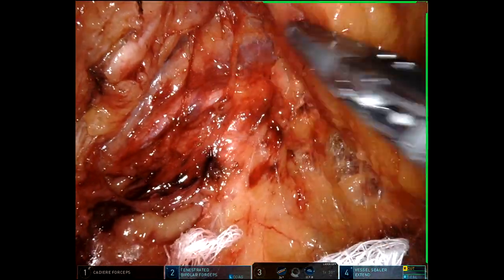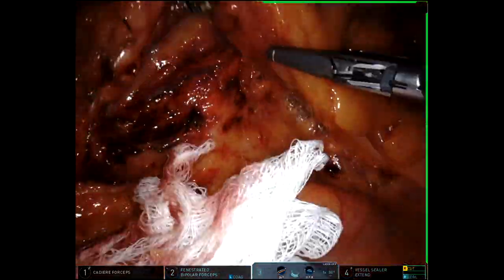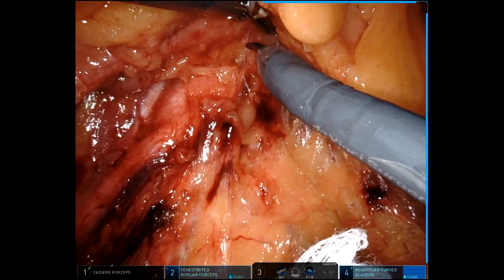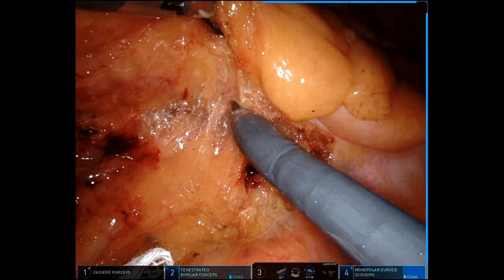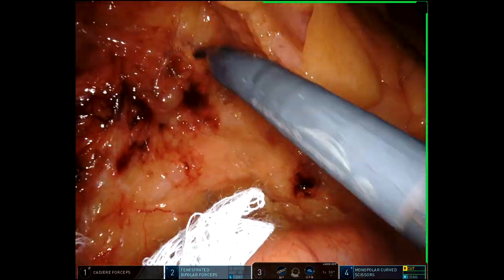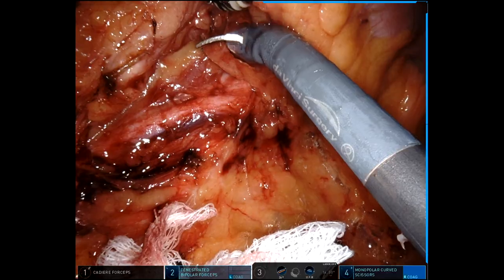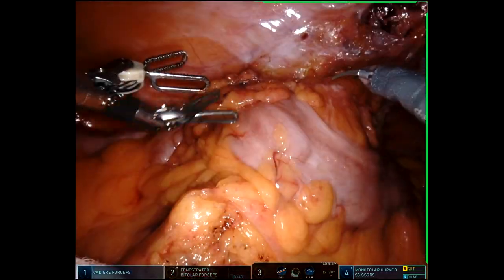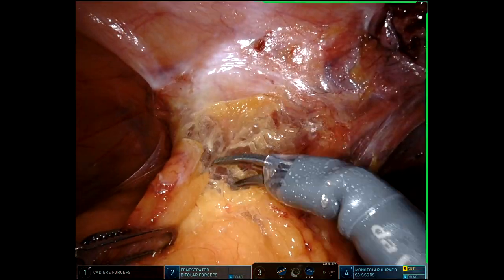I'll do a little more of my medial dissection — you can see the ureter there posteriorly that I'm sweeping down. And then I'll do a little bit of a TME dissection in the upper rectum, since I know that I'm going to need to go to the upper rectum for my distal margin. Once I feel like I've done enough of a medial dissection, I'll put a sponge back there to protect the ureter, and go ahead and start the lateral dissection.